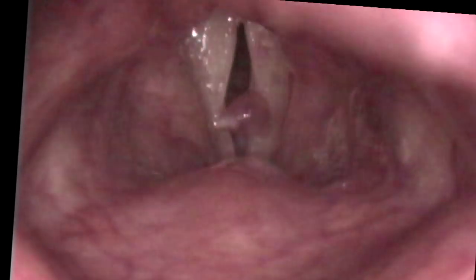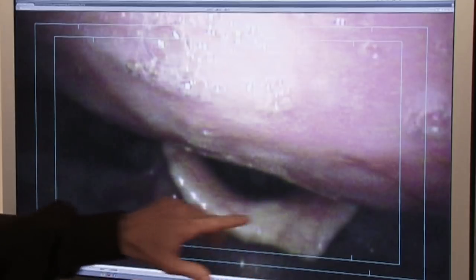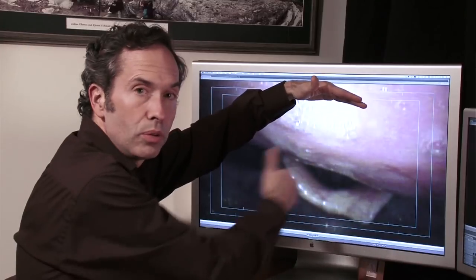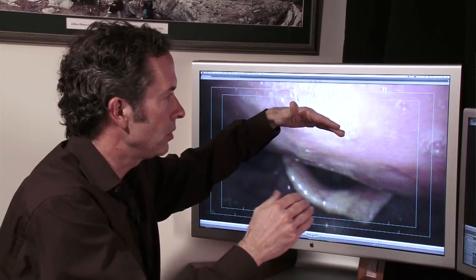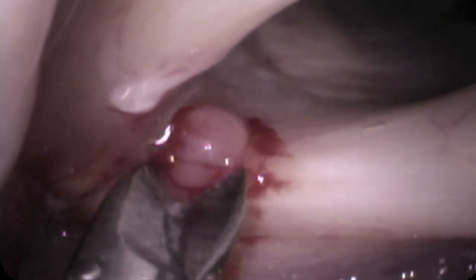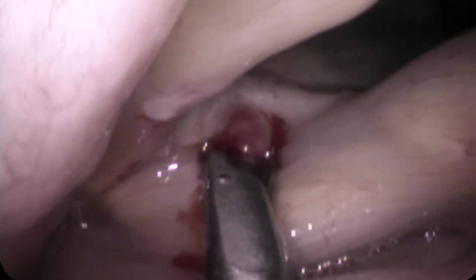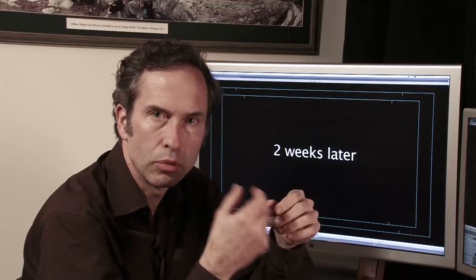The reason for operating in the office: here's his view of the vocal cords in the distance, with the epiglottis and a big spinal spur. Ordinarily we'd see the whole larynx in the view, but I can't reach that with a rigid endoscope. In the office, I can snake a flexible endoscope around the spur, get a close-up view of his vocal cords, put scissors through his mouth, and snip off the hemorrhagic polyp. One reason I show this is that at the end there's a little bump of tissue left — so it's not as precise as in the operating room.